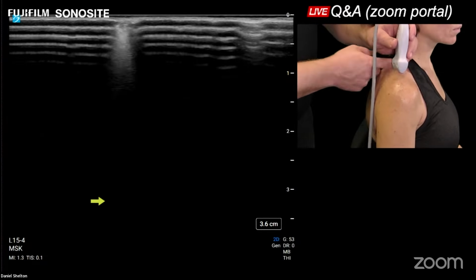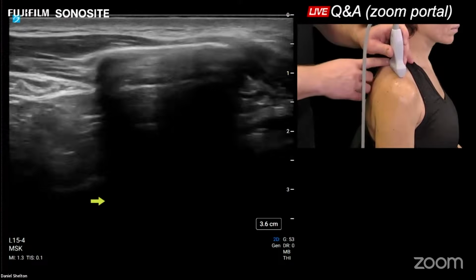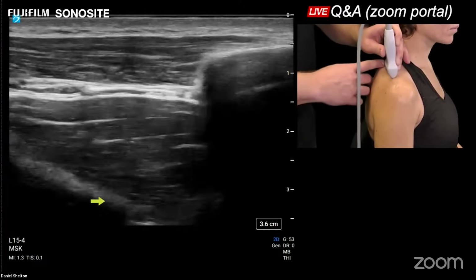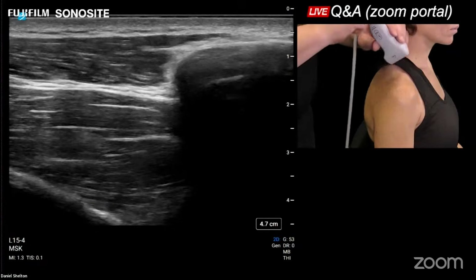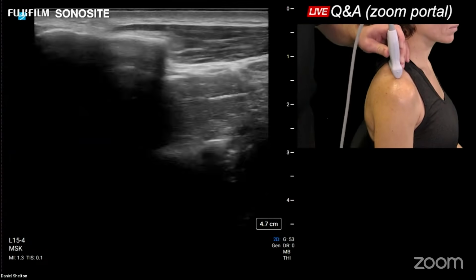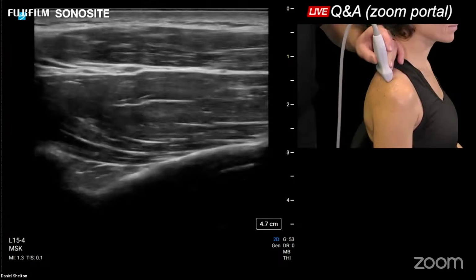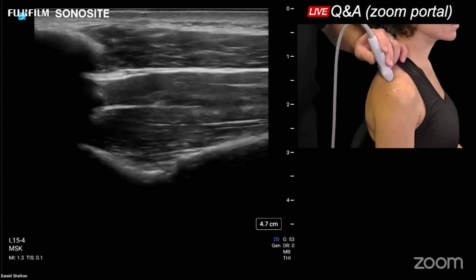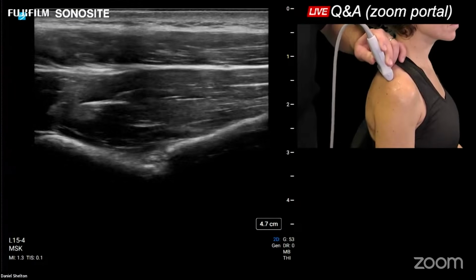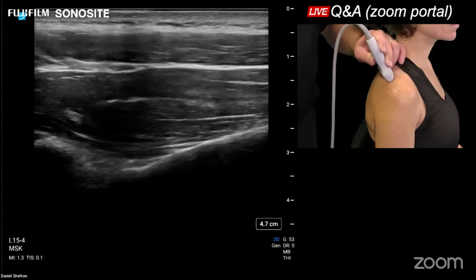All right, so that covers the basics of the rotator cuff structures, and then recapping the AC joint right up top. Supraspinatus fossa contents are bonus, not a part of a protocol, but you might as well check up there and see what you can see when it comes to cysts and other pain generators, like things around the nerve. Is the supraspinatus muscle belly nice and healthy? Is it dark all the way out to the rim?